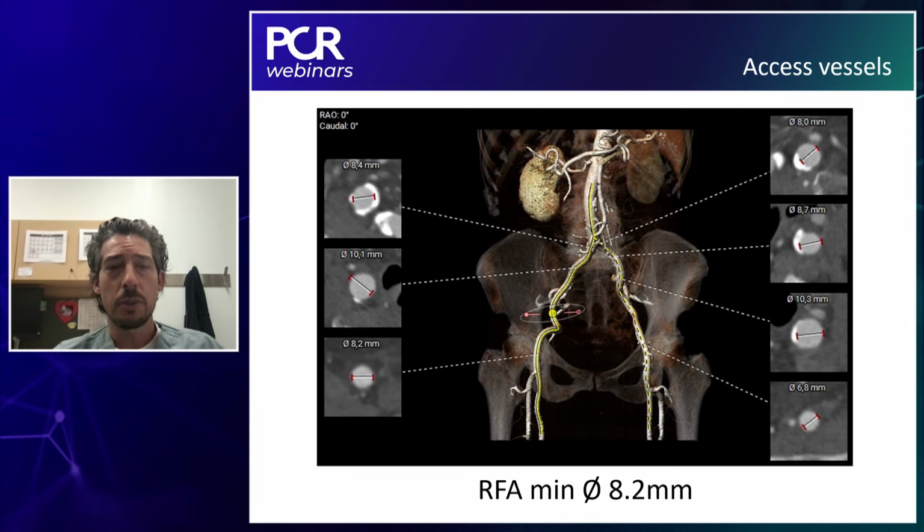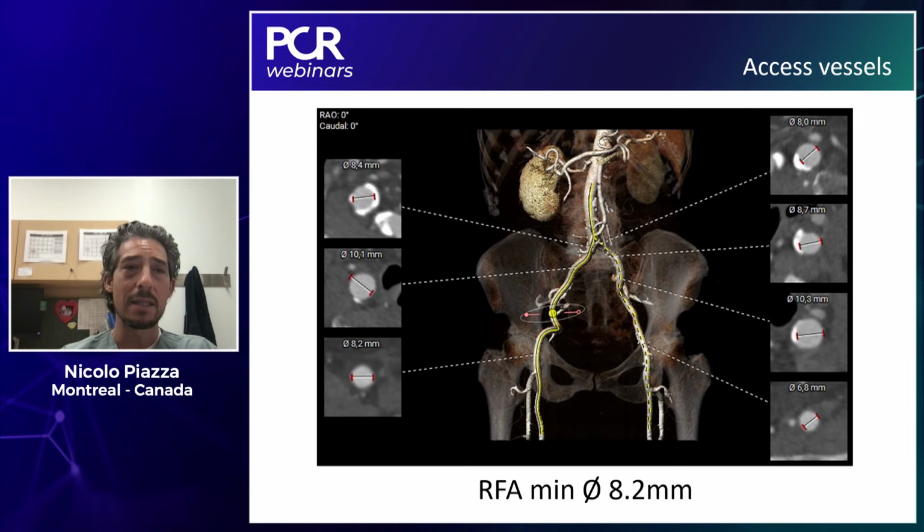Lars, patient-prosthesis mismatch basically means that the patient has a normally functioning prosthesis, but the prosthesis is too small for the patient's body size. And so PPM, as they call it, not for permanent pacemaker, but for patient-prosthesis mismatch, really is the effective orifice area that you calculate after your procedure, divided by the body surface area.